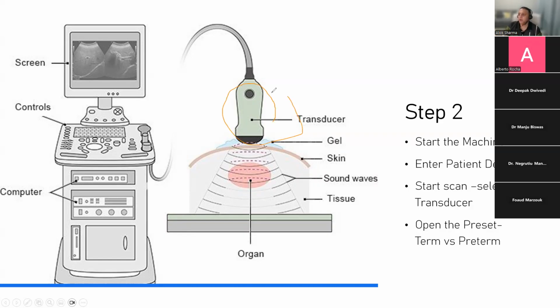So the entire probe, including everything that's going into the baby's incubator. We are also encouraged before and after to clean the motherboard. I don't necessarily clean the screen unless I have to touch it, if you have a touch screen. But if you have a touch screen, you're going to have to clean the screen as well, and you have to do it before and after.